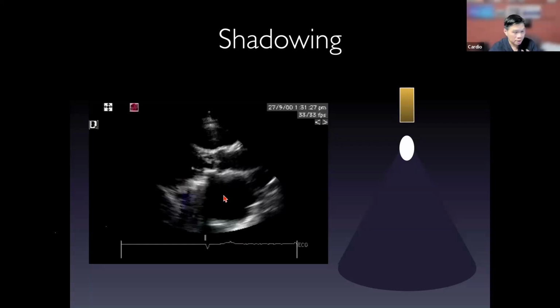So for example, if you are wondering about mitral regurgitation in transthoracic, then what you can do is, in parasternal, angle differently to see if you can see mitral regurgitation either around the ring or inside the mechanical valve.